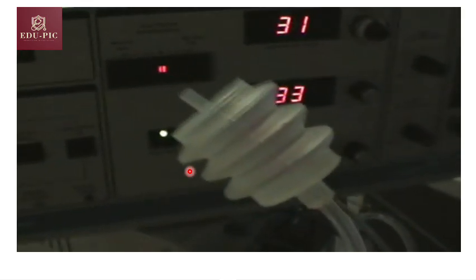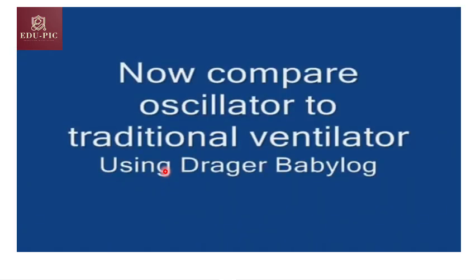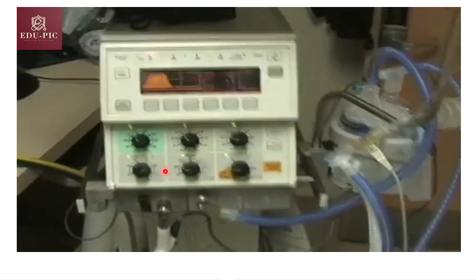the lung. This is the idea of high frequency ventilation: to give a very, very small volume with a very small pressure at a very high rate, just to give the lung time to recover.